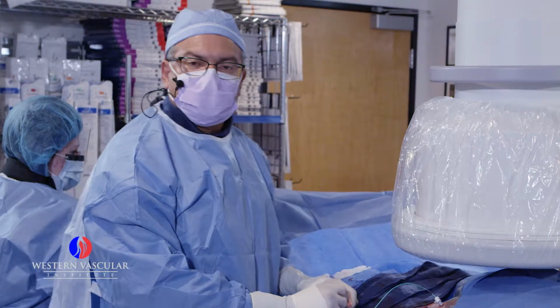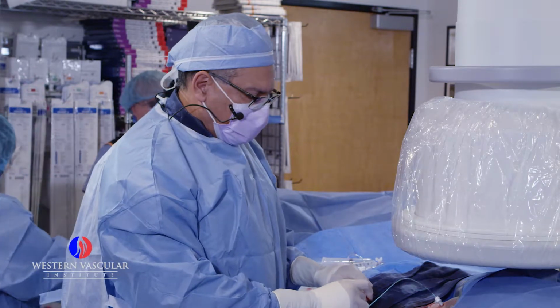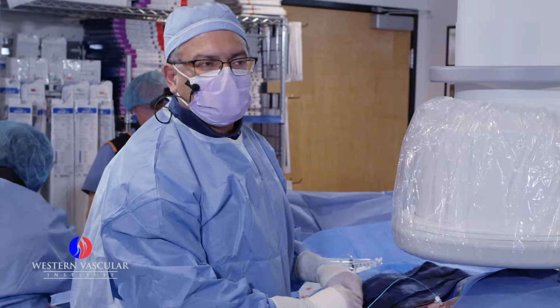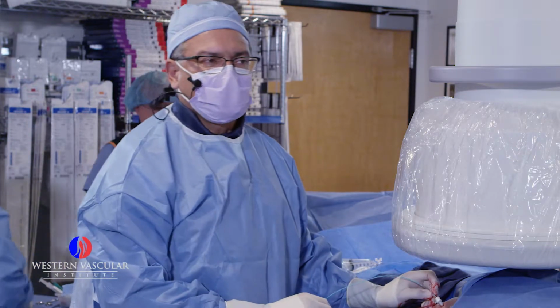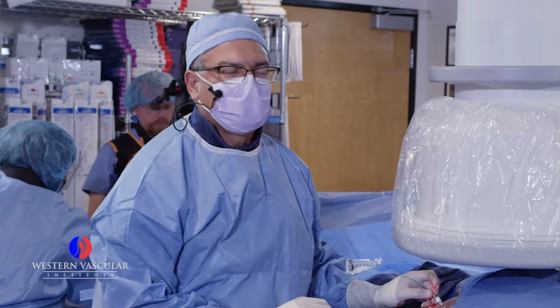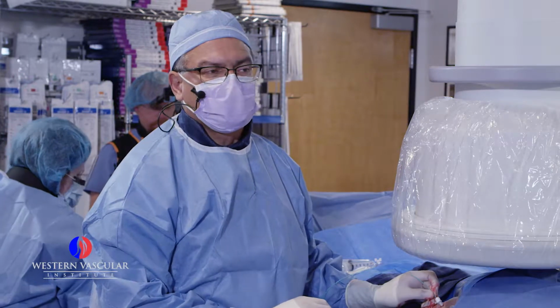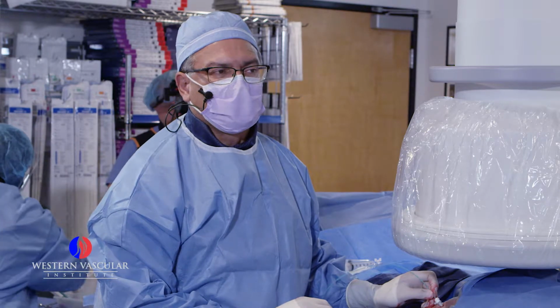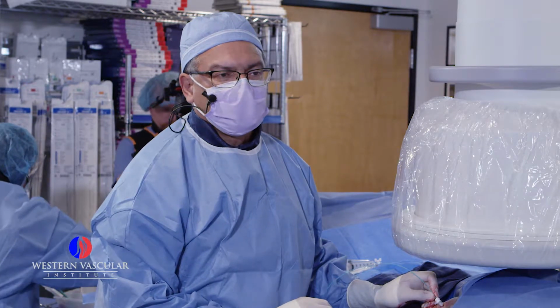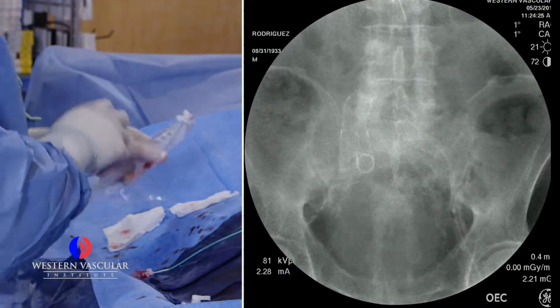Now, since the patient has some renal impairment, that means some insufficiency of the kidney function, we don't want to use iodine contrast because it may make it difficult for his renal clearance and the function of the kidney. In those kinds of scenarios, we use CO2. It will protect the renal function and avoid problems with the kidneys.